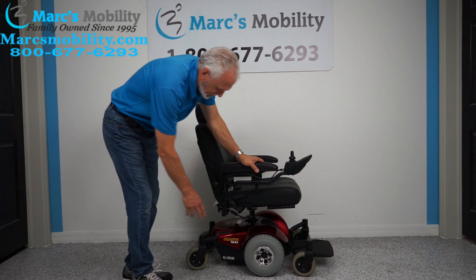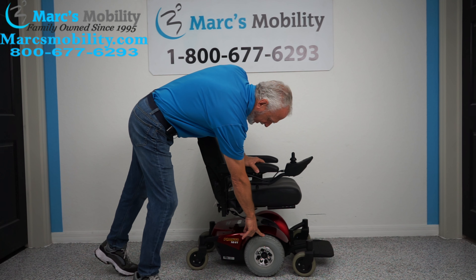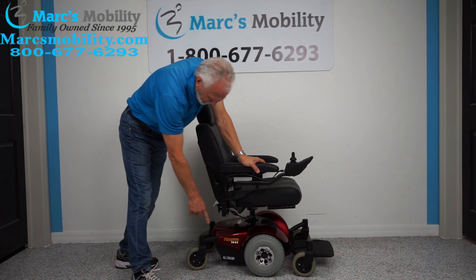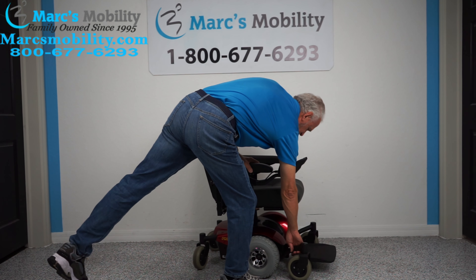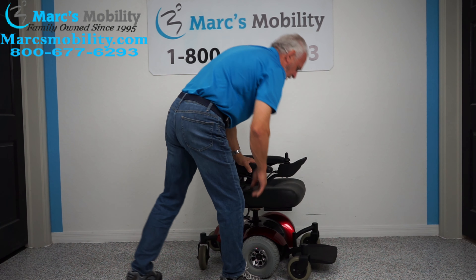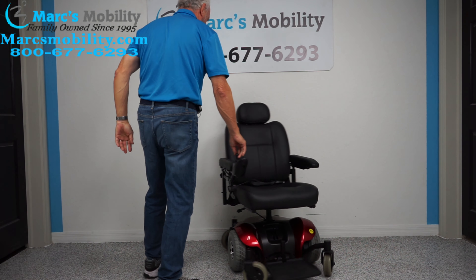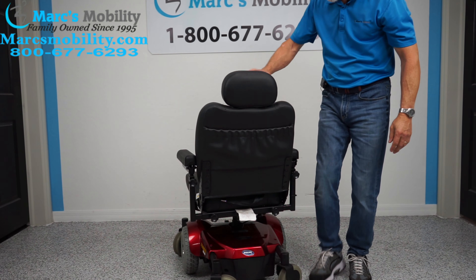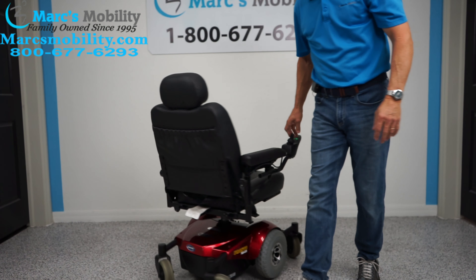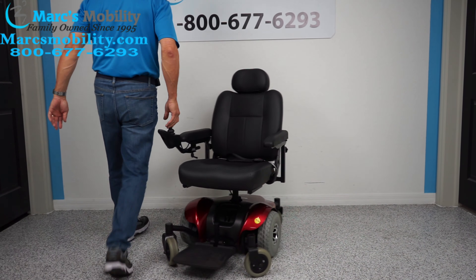We have on this power chair 10-inch solid tires, caster wheels in the front and caster wheels in the back, and you can see the suspension when I raise the front wheels. It has a really good turning radius, so if you're in the house you can put a box right here and a box in front of it — this chair turns on a real small turning radius.